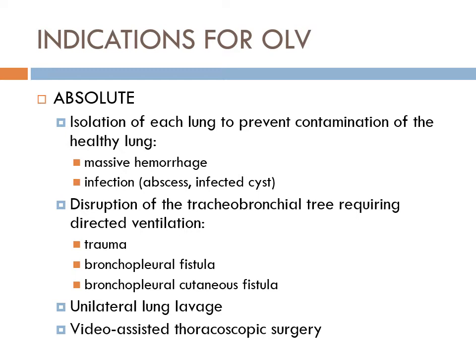So the bad stuff could come out of the tube to the atmosphere, right? It could come out to where your workspace is, but it's not going to go into here. Now, if you're ventilating, each side is connected to its own port, right? So this is one port with your cone thing on here that can fit, and this is your other one. So you can choose to only send your circuit to one side. We're going to have nothing to the left side. Here's your circuit going to your vent. We're only ventilating one side.